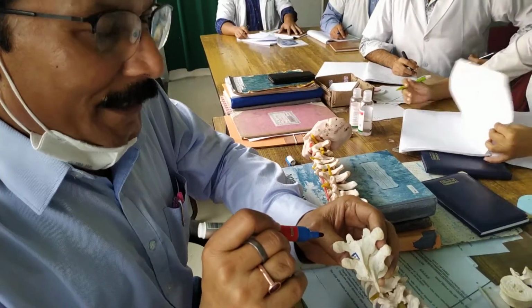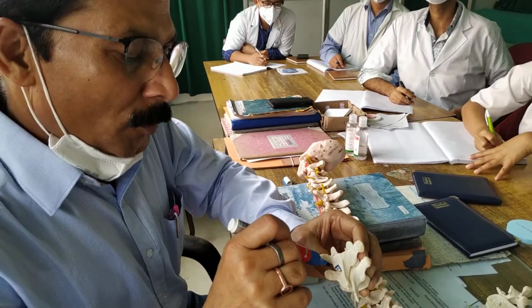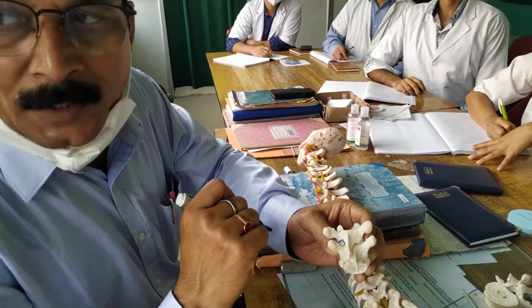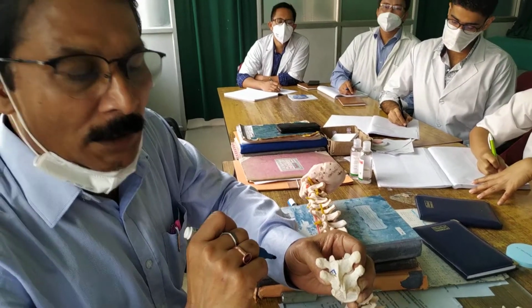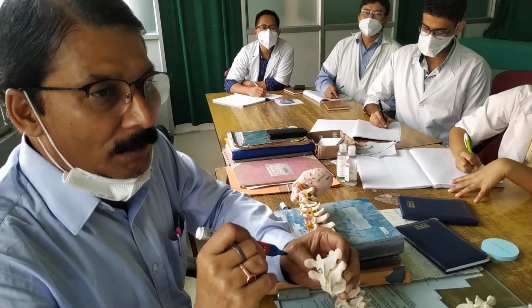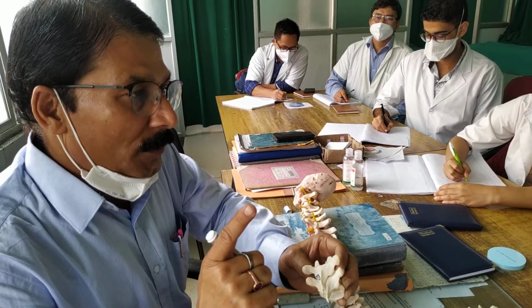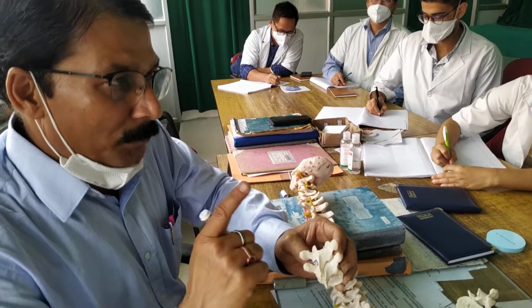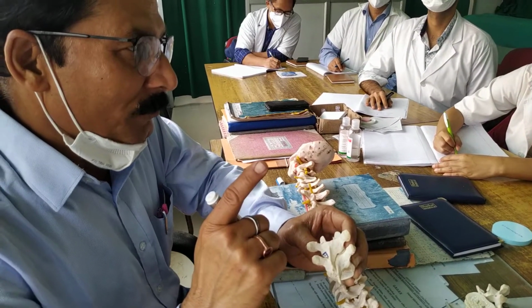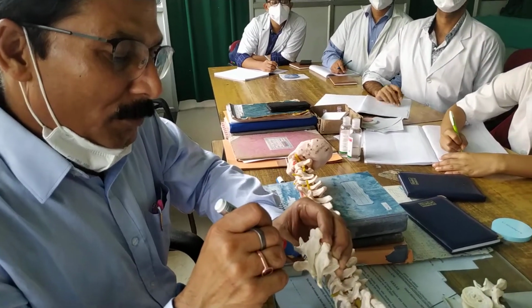Now, as I said, it is always mandatory to look for the transverse process, do dissection of the superior border, and do dissection of the inferior border. Right? If necessary, go to the tip. Now, you have to find three parts of the transverse process. In the lumbar vertebra, I told you that you need to find the midline, bisecting it into two halves. The midline is important.